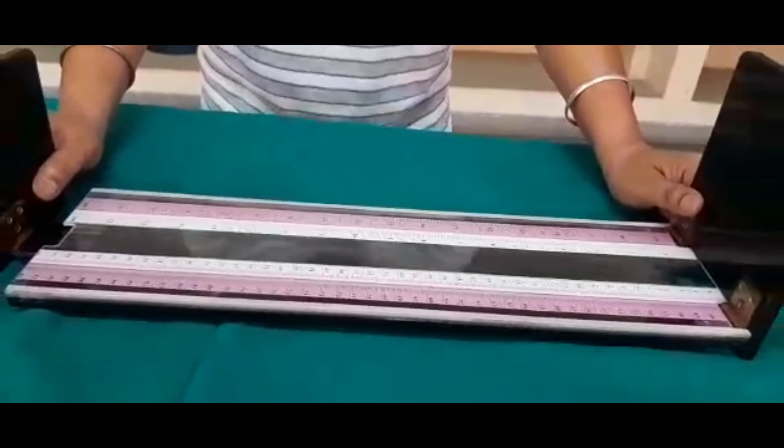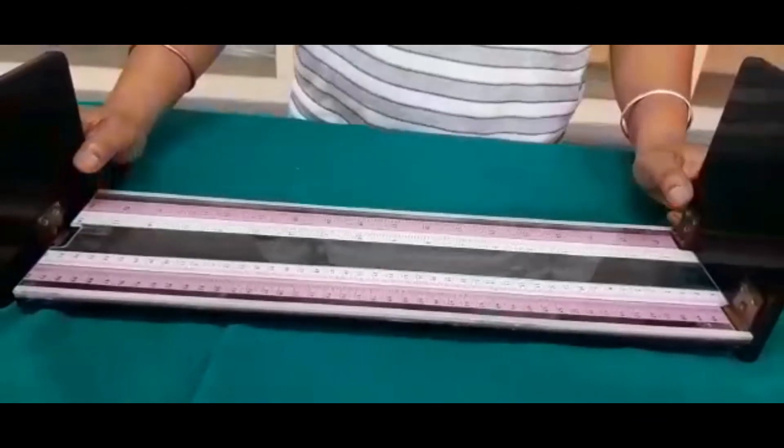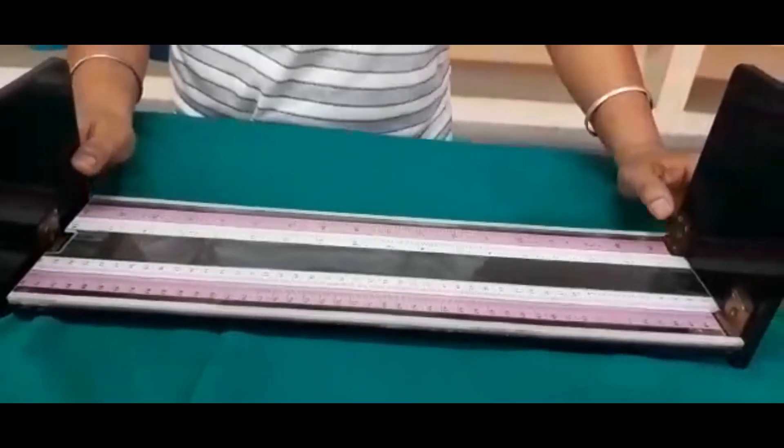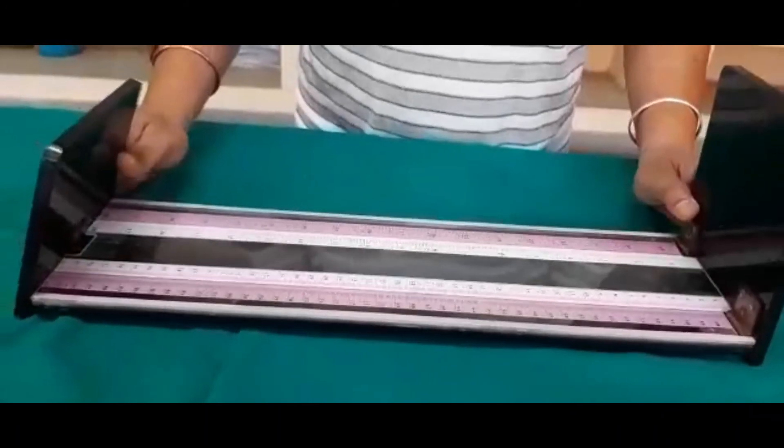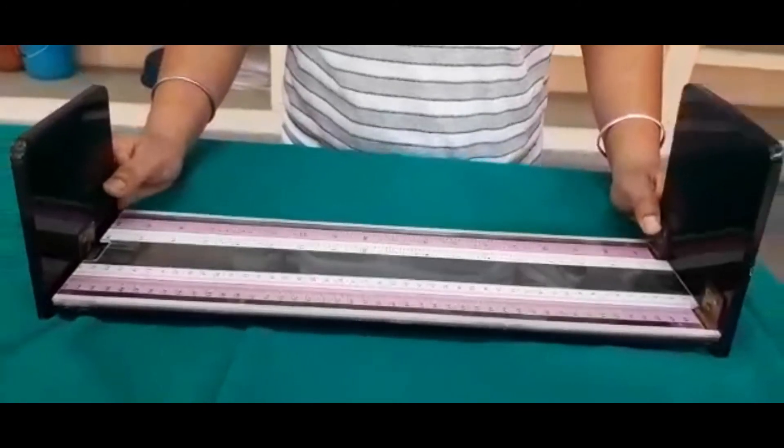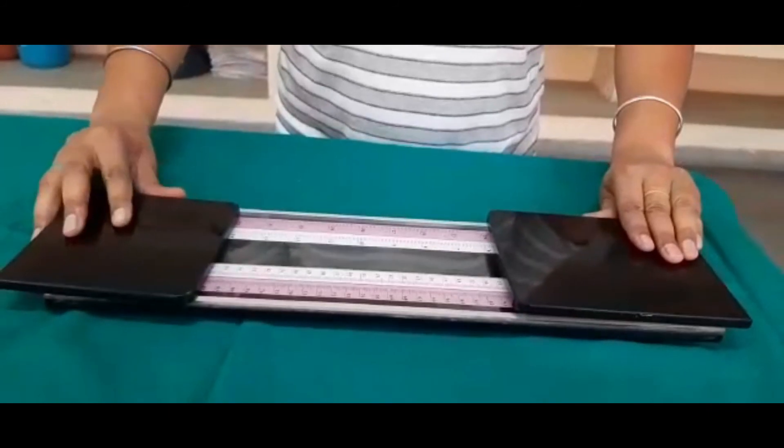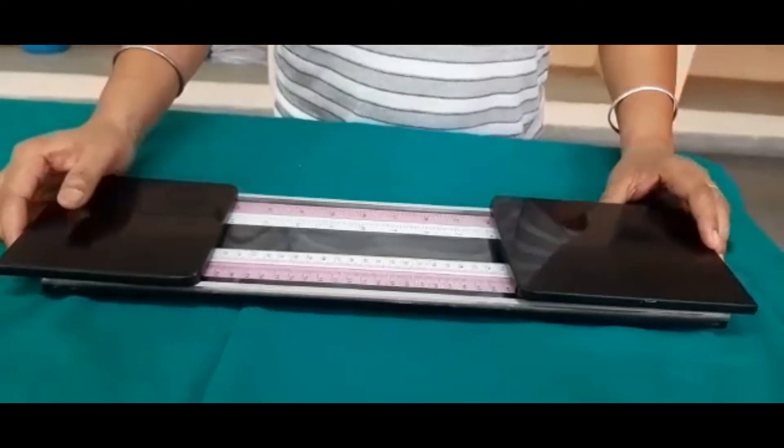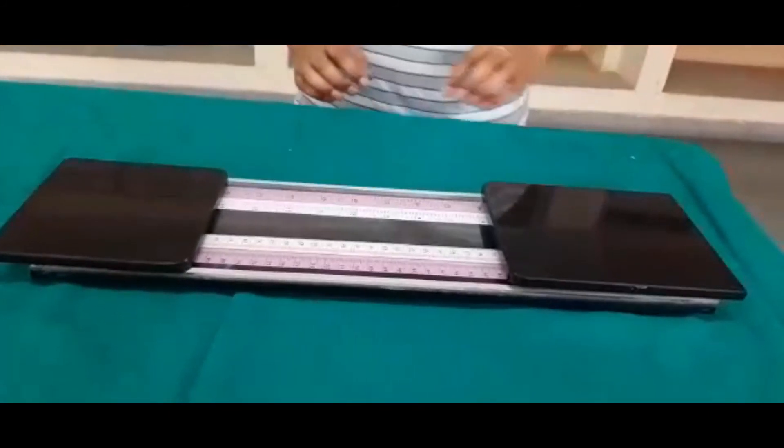That's why the name of this instrument is infantometer. I hope you are clear with this. And in this way, after that, we again clean this and close this. Thank you so much. I hope you are clear with this.